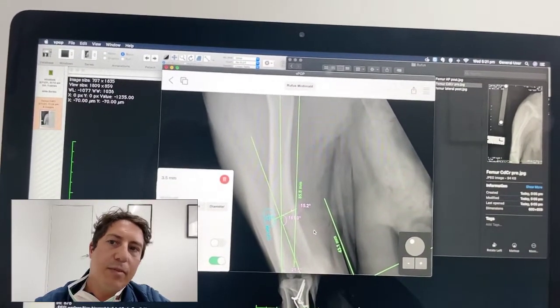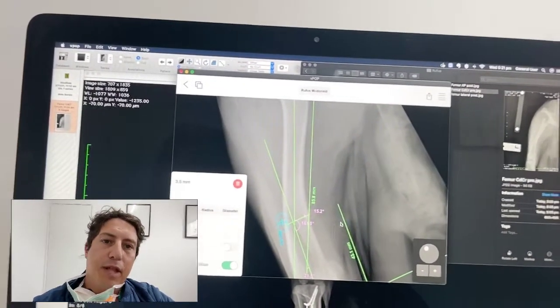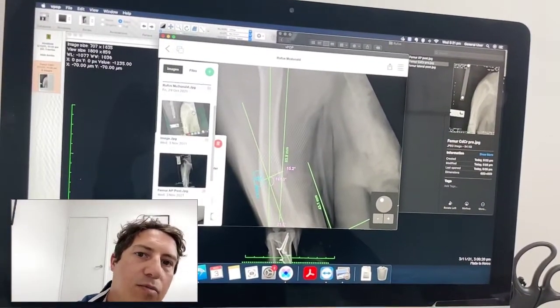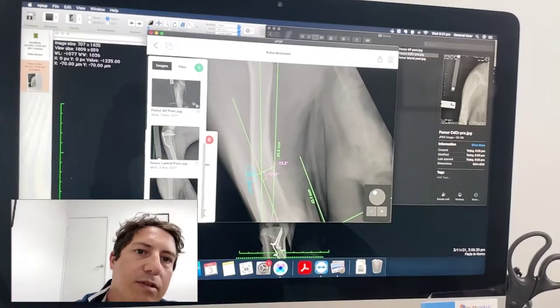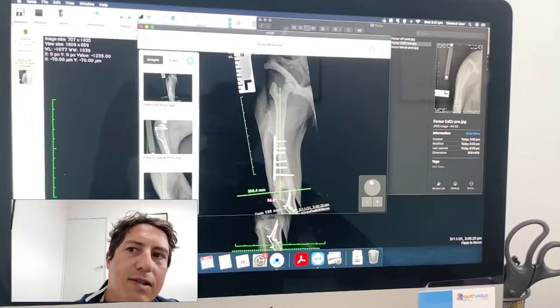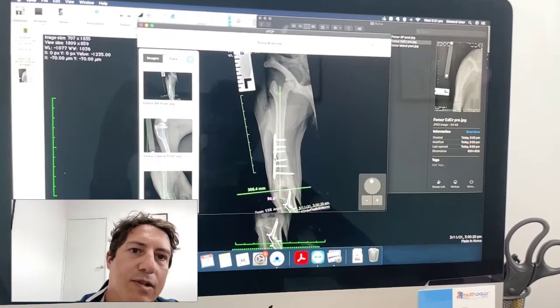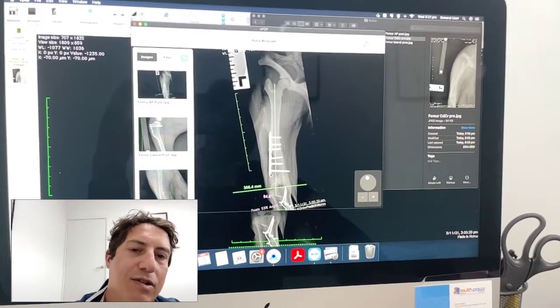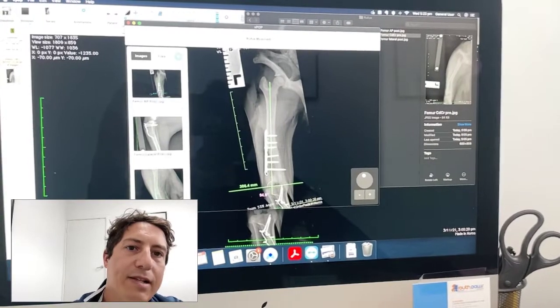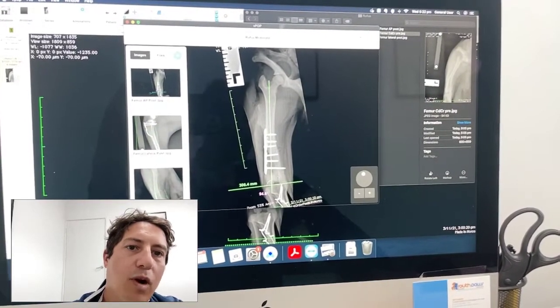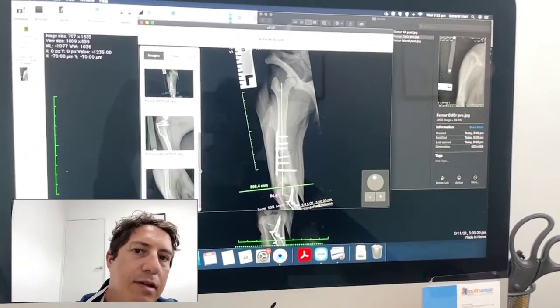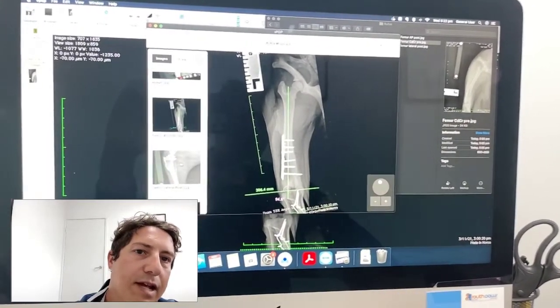When we come back and look at the post-op x-rays to see how good a job we did — here is the radiograph — we can see our anatomic axis now down here, we can see where we made our osteotomy to straighten the leg out. We actually just used a 2.4 locking straight plate in this case because the CORA was quite far away from the joint, so I didn't need to use a specific DFO plate.